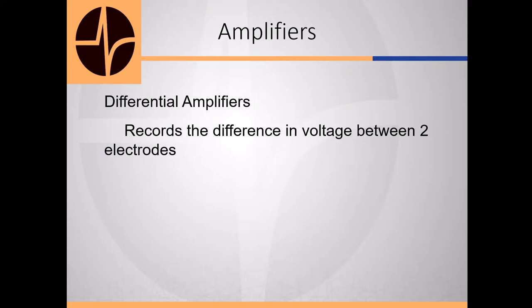In SSEPs, negative goes up, N20. In auditories, negative goes down. And in visual evoked potentials, generally in the US, negative goes up and positive goes down. But in Europe and in the hospital I trained in, because our doctor was from Italy, our visuals, our positivity went up.